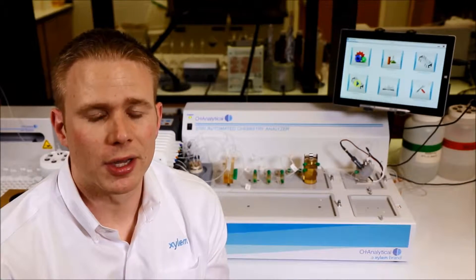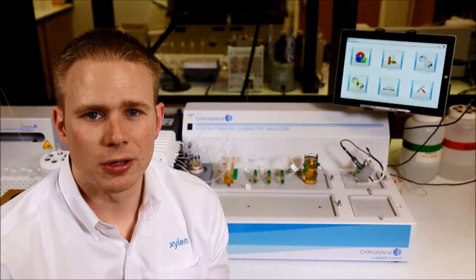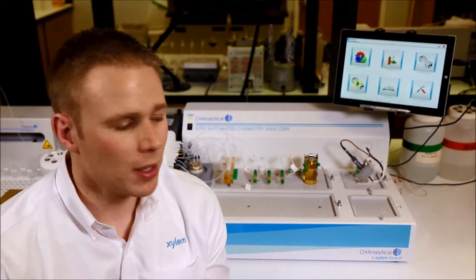Behind me is the FlowSolution 3700 and FlowView software, our latest generation of automated chemistry analyzers. Our design philosophy in coming out with the 3700 was to really take all of the technological improvements we've made over the last 20 years and put them into an easy, user-friendly package.